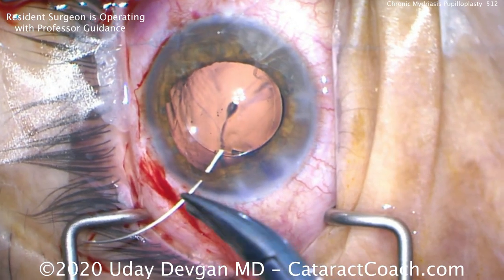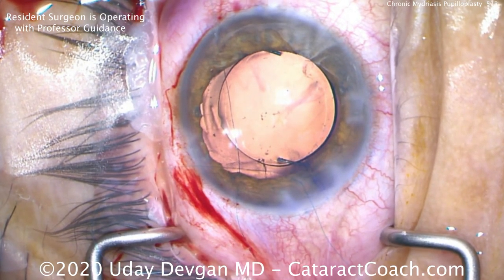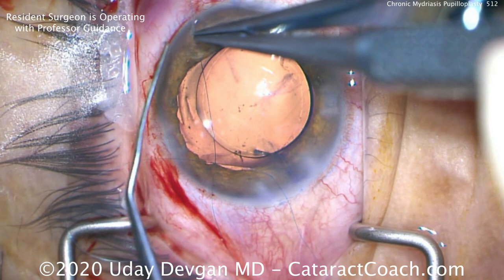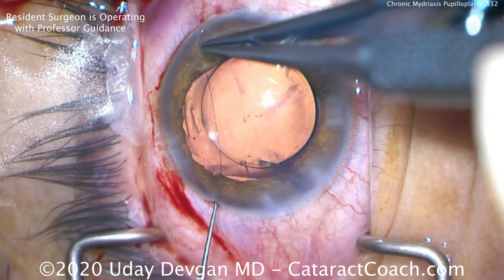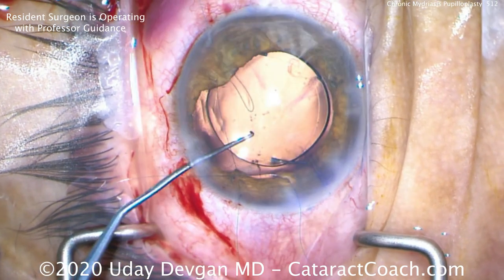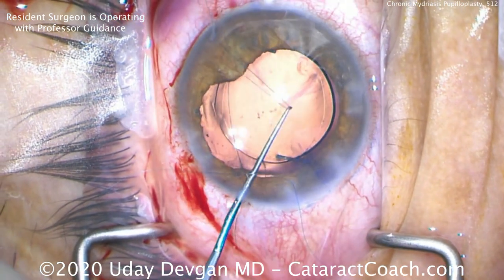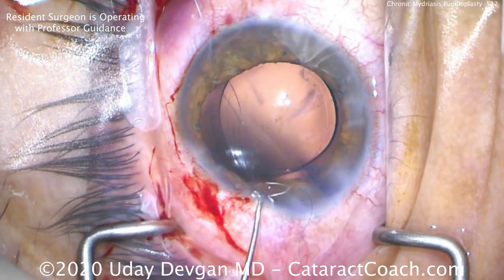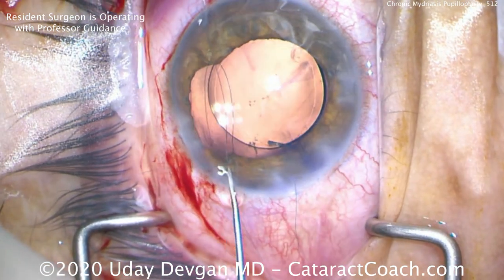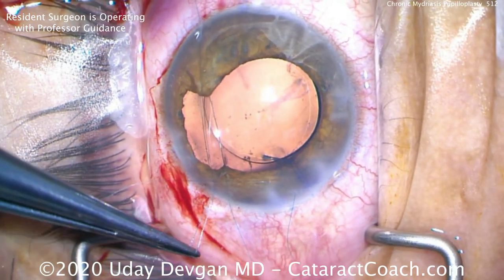We can now cut the needle off and use a combination of techniques — basically the Sipser knot technique. So grabbing here, there's the suture loop coming on top of the lens. We'll grab that loop and bring it out of this same paracentesis. This is the Sipser knot technique, using an iris push-pull to facilitate that. Now that we have a loop outside the eye, we're going to use what Amar Agarwal taught me.